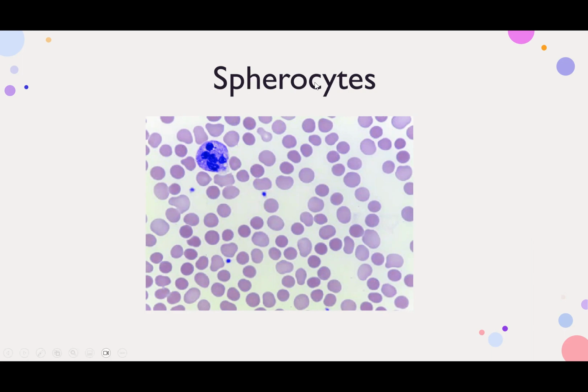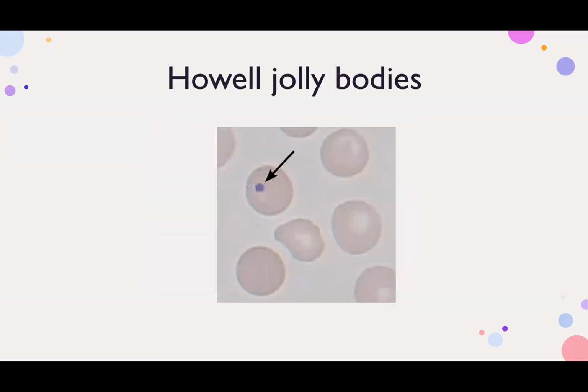MCHC in spherocytosis. And this is very common in exams. So they give you a scenario of a patient with anemia and family history. Well, MCHC is high. What's the diagnosis? It's spherocytosis, because if you have an increase in the central pallor, a decrease in the central pallor means there is absence of the central pallor. No central pallor means this is hyperchromia, meaning the MCHC is high.